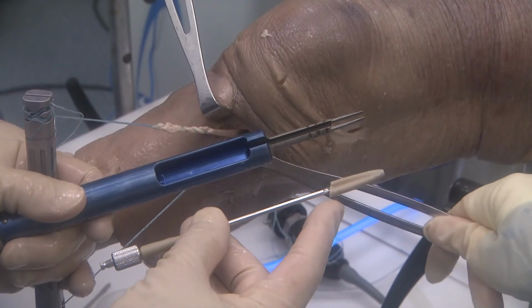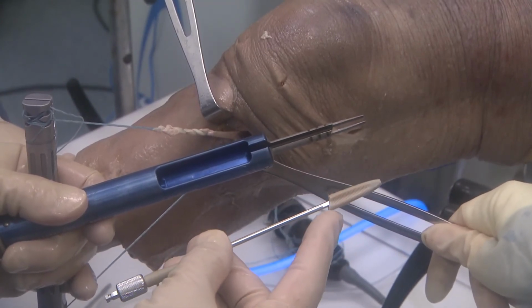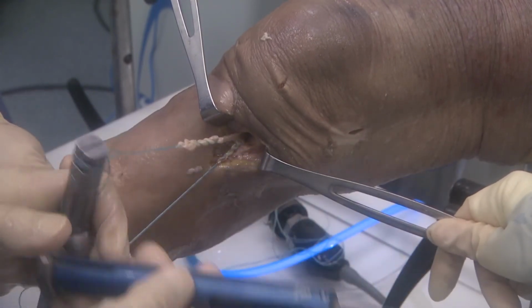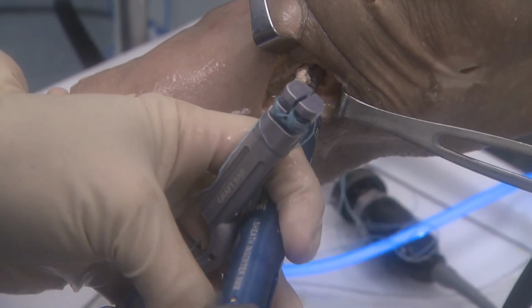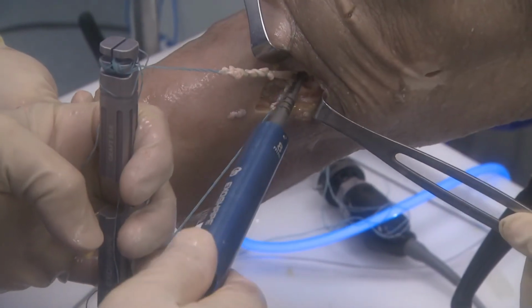These are color coded. It's obliquely oriented, and you need to place this portion anteriorly and this portion posteriorly. And when you place it on the implant, make sure that it's seated correctly like that. So I insert this between my 2 tendons, and I insert down to a +5. Then I remove the insertion device.